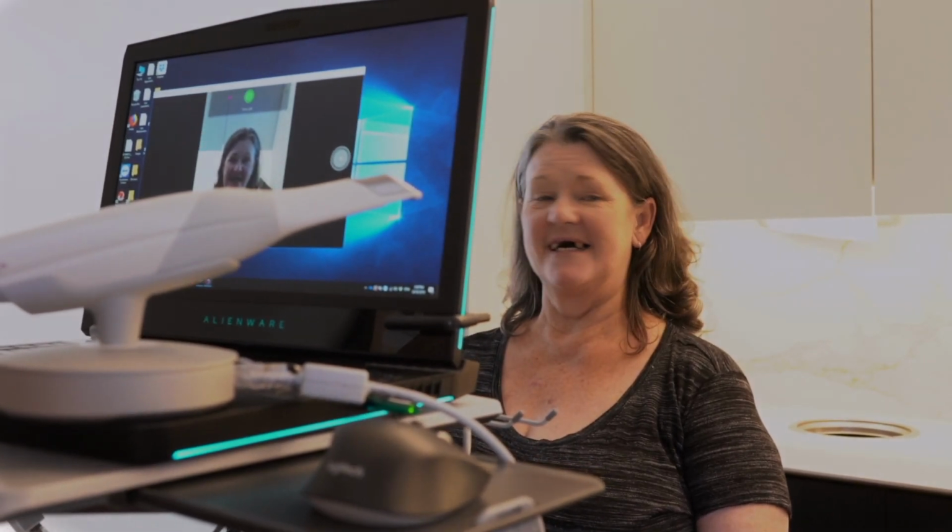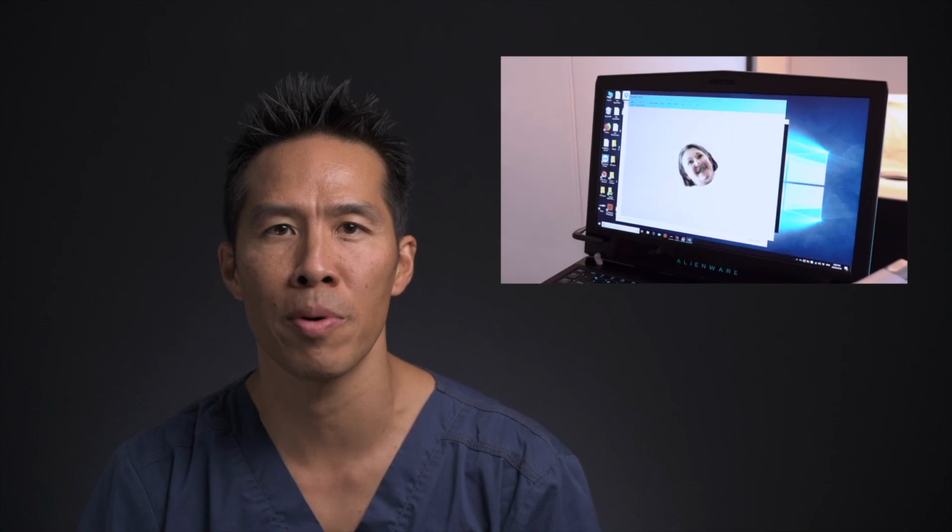The third thing is facial scans. We all know from iPhones that we can actually use our face to unlock our phones, and this technology has actually been around for a long time, but now we can take 3D scans of the patient's face, and this allows us to place the teeth in the exact position that we want to before we do surgery, so it's much more predictable and we know exactly how the cosmetics are going to look before we do treatment.